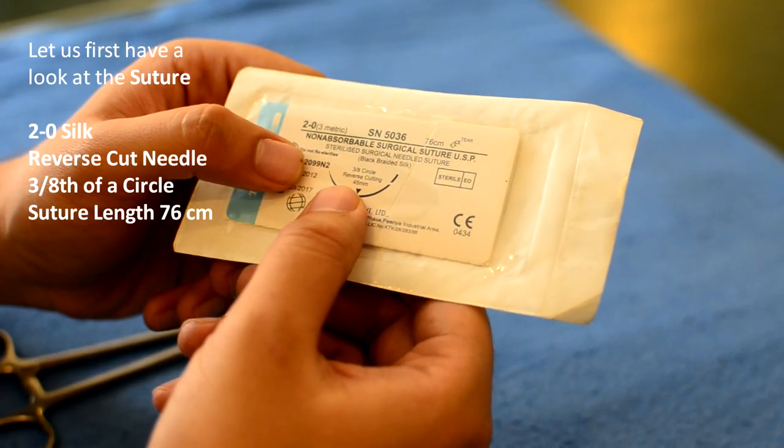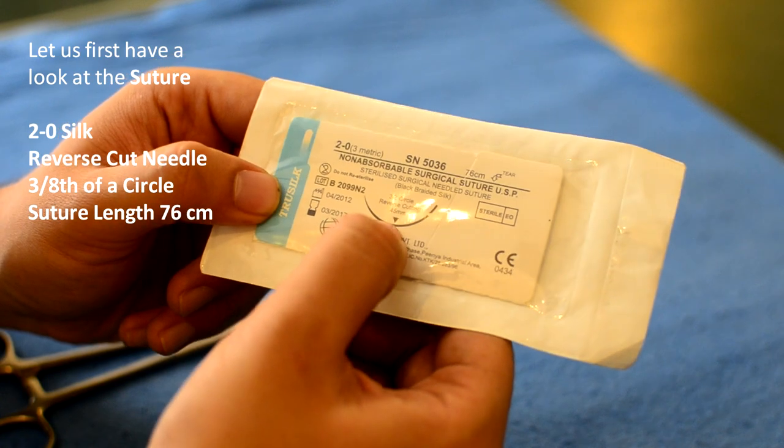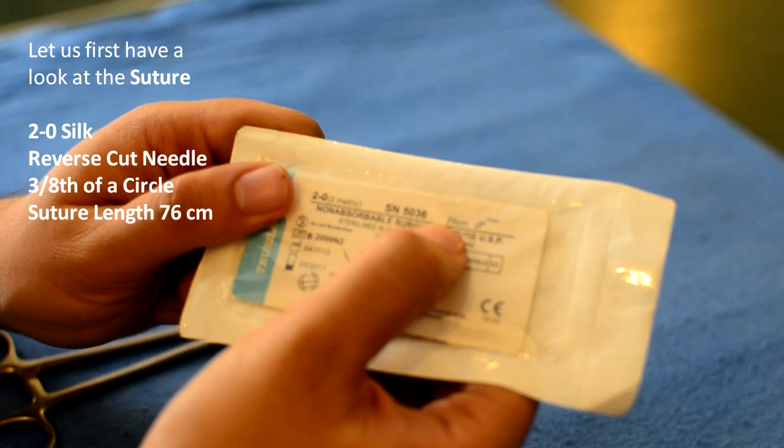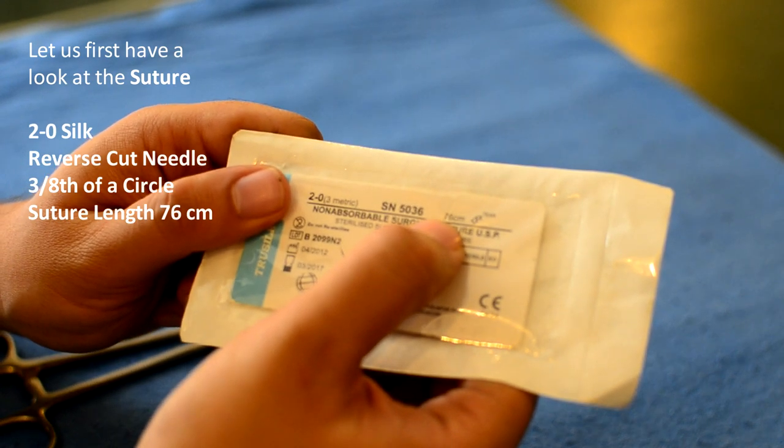Let's first take a look at the suture. What we have in hand is a 2-0 silk suture with a reverse cut needle. It's in 3-8 of a circle and the length of the suture is 76 cm.